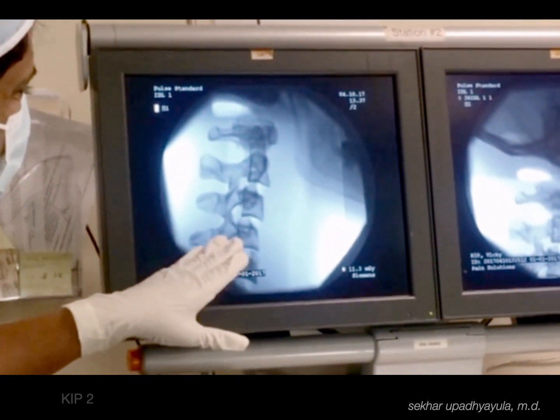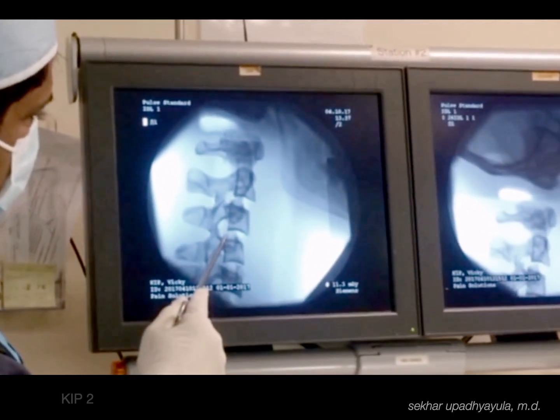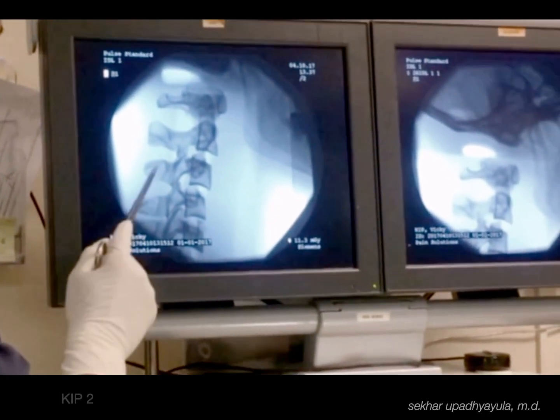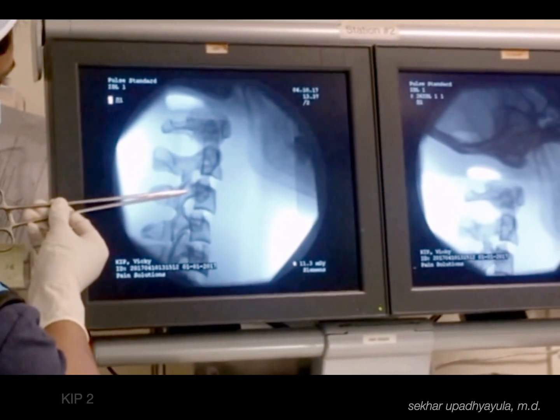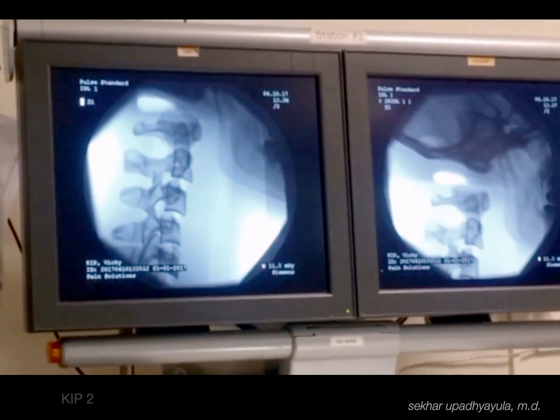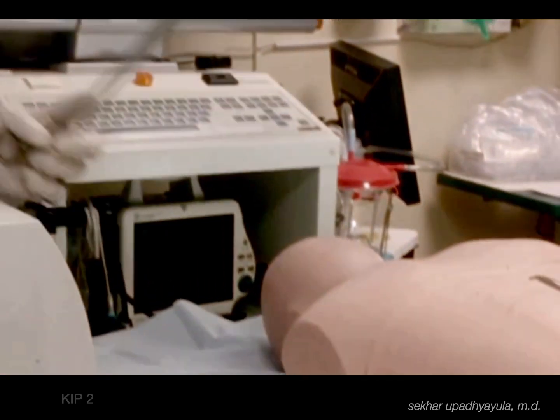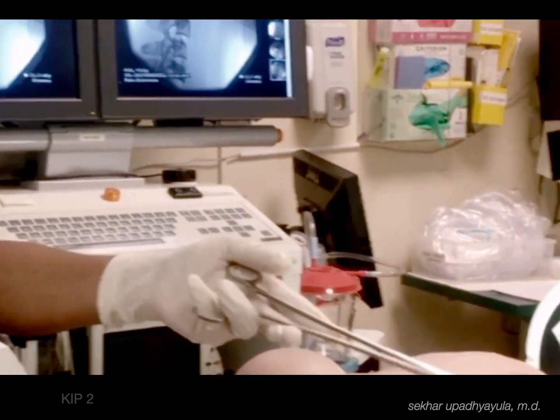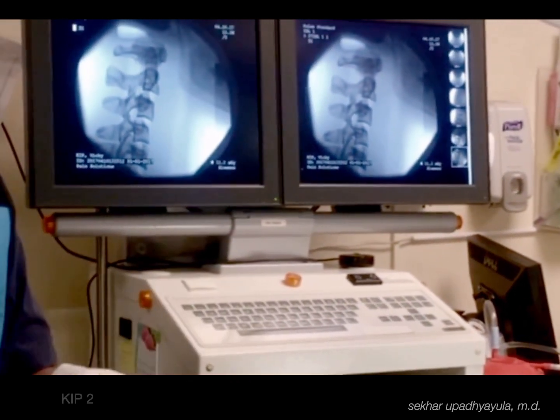And this is a fairly nice lateral view. You can see, well, this is where the disc would be sitting right in here. This is the body, posterior spinous process, and if we were doing medial branch blocks, we would want our needle tip on a lateral view to sit or hug somewhere in this area. So anatomically, this looks really, really quite good. Let's face it, the purpose of the Phantom is to get our basic raw skills on doing injections in the neck, thoracic, lumbar, or the caudal space. And I think this Phantom is going to be more than adequate for teaching for that purpose.